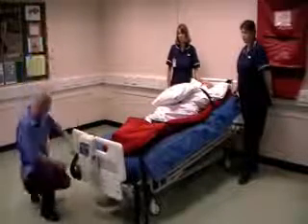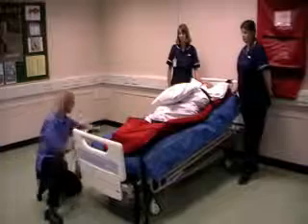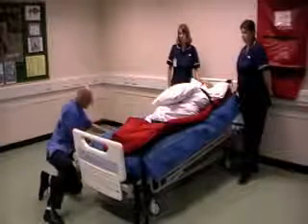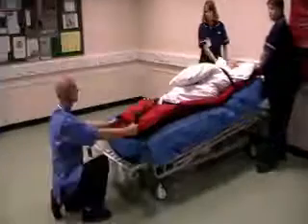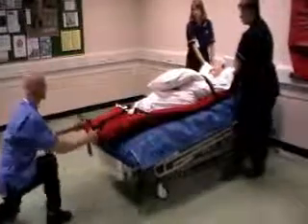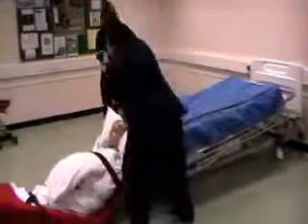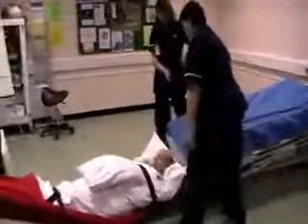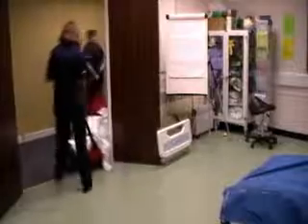Move the bed to its lowest level and tilt the foot down. Remove the end of the bed. Preferably, one handler should grasp the ski pad loops at the end of the bed and bring the pad onto the floor. Two people must take care to protect the head end as it comes off the bed. When off the bed, one person from the top helps the person at the foot end to move the patient towards the stairs.